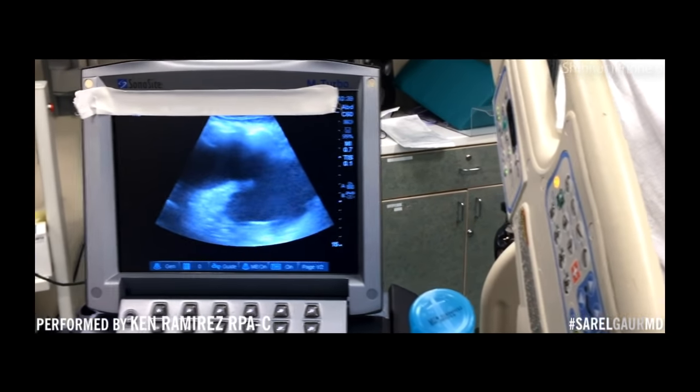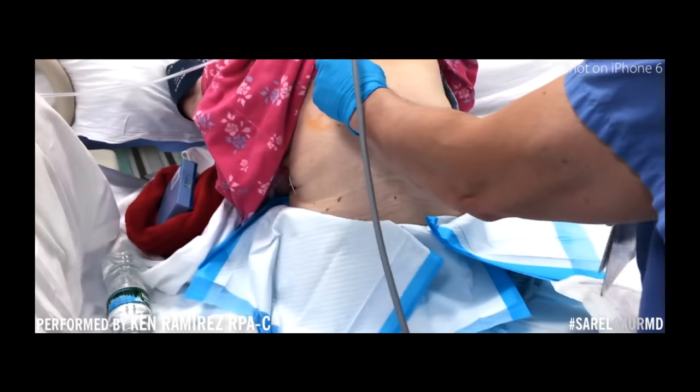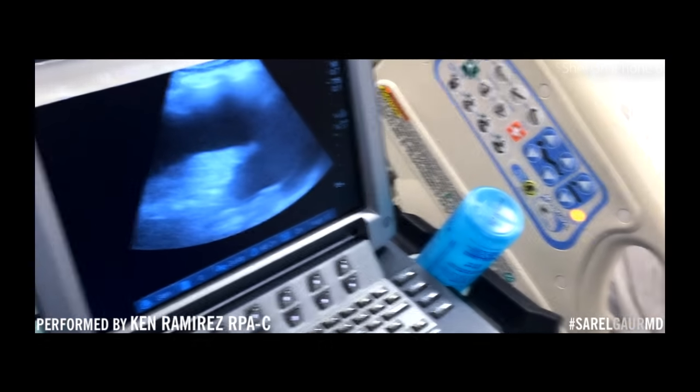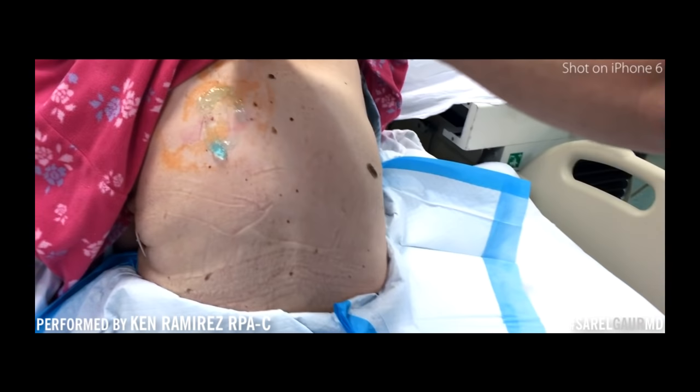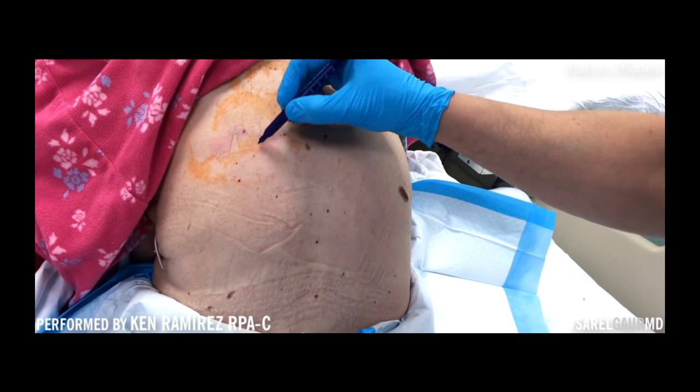So we've identified where we want to put our catheter in order to access the fluid and drain it. We'll mark that.